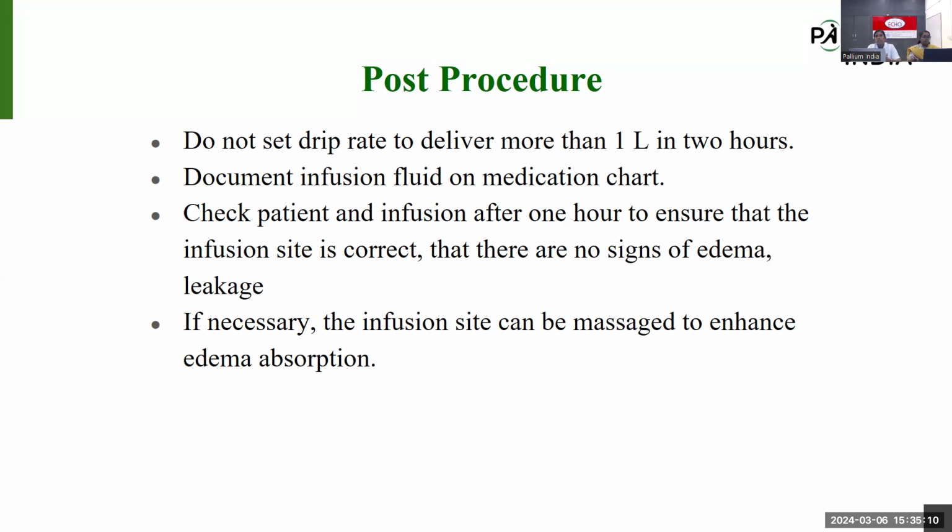So before starting the procedure, we should explain the potential complications or side effects that we are expecting from the subcutaneous infusion. If we are setting more than 20 drops per minute, there is a chance of development of edema on that area, and this will lead to leakage from the infusion site. So diffusion is happening, so it will take some time, and we should ensure there are no signs of edema and leakage from the infusion site. And if necessary, the infusion site can be massaged to enhance edema absorption.